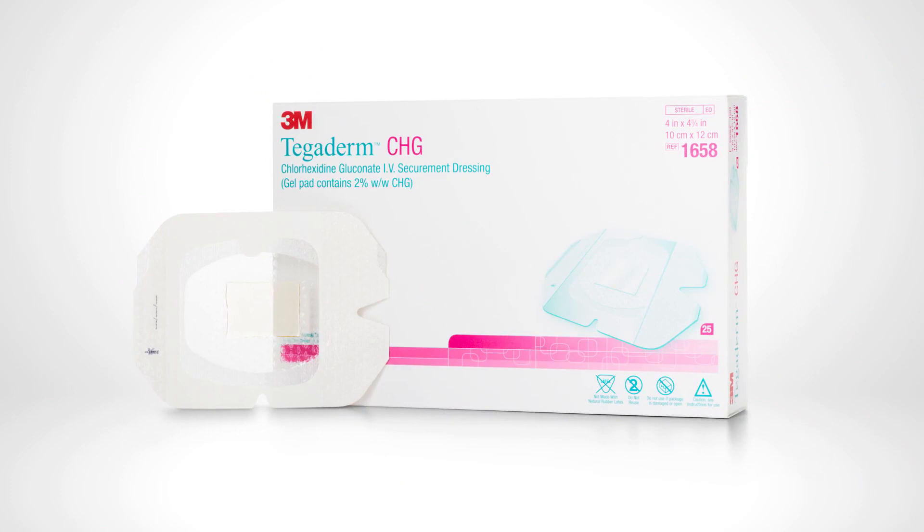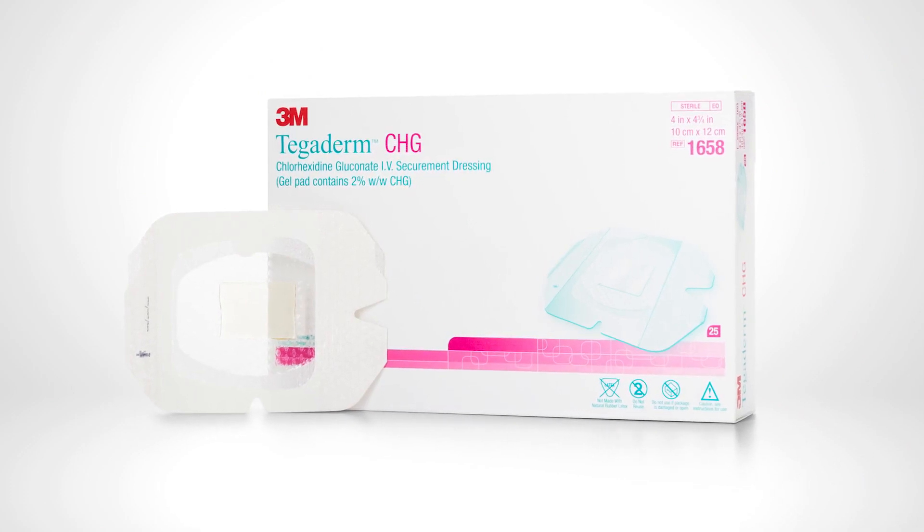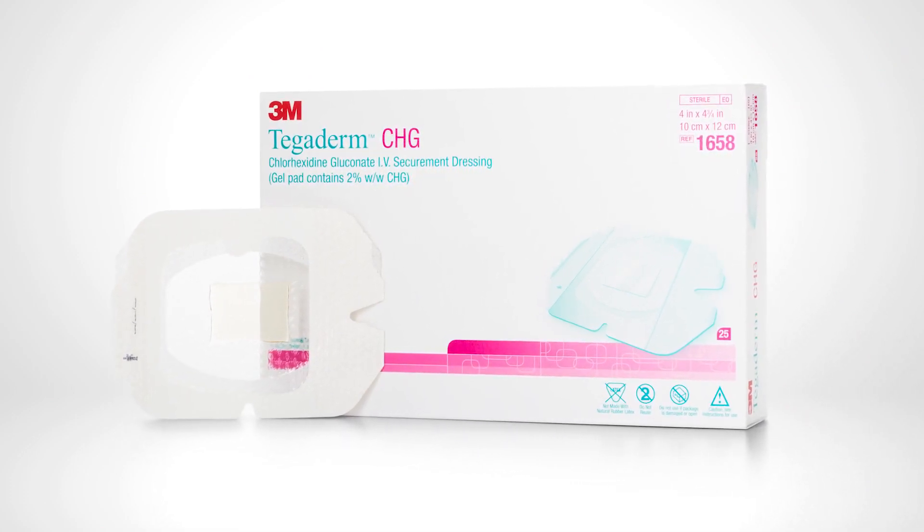This concludes the overview of placement, monitoring, and removal of the 3M Tegaderm CHG dressing on a PICC IV site.